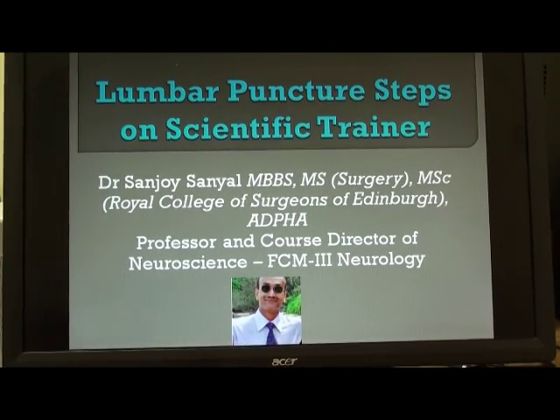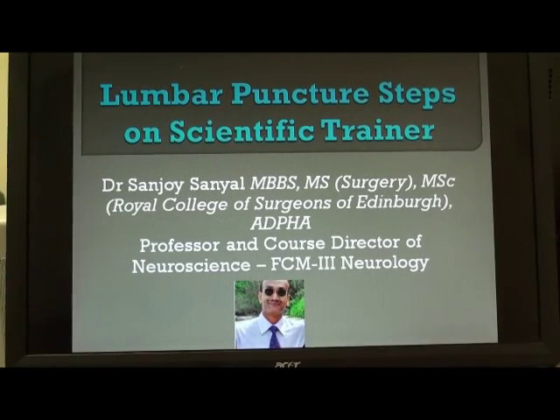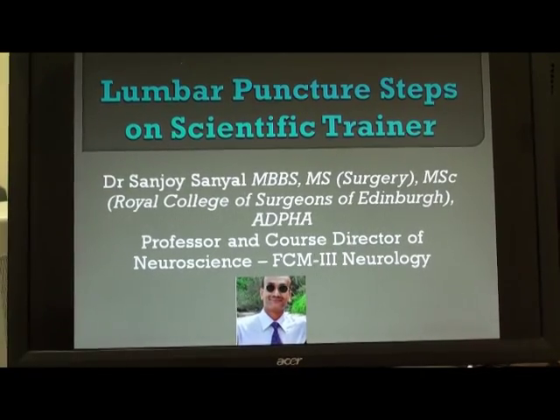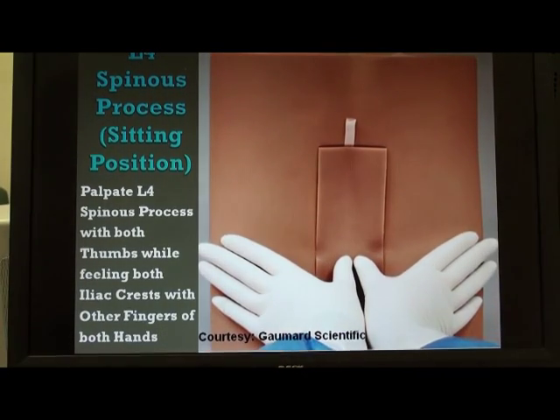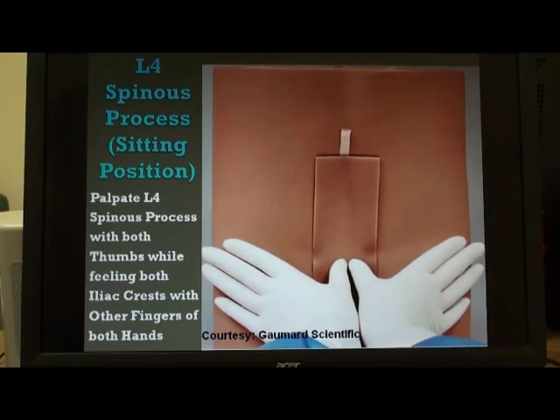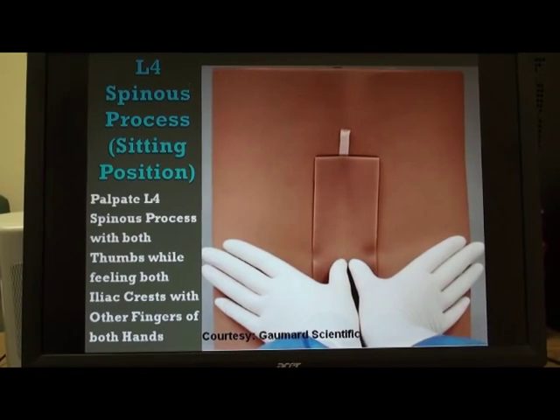In this video, we shall demonstrate the technique and steps of lumbar puncture as we do it on a scientific trainer which we have procured from the company called Gormard Scientific with special permission. This Gormard Scientific trainer is a mannequin, a semi-heavy mannequin, and it simulates exactly how it feels to do a lumbar puncture on a human being.